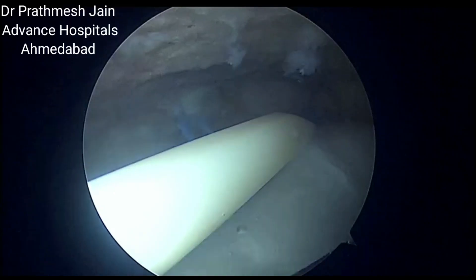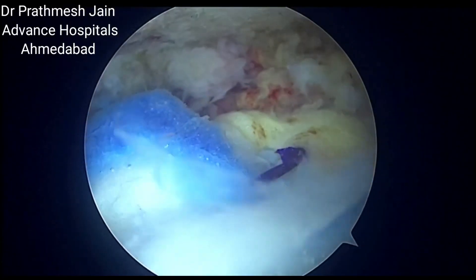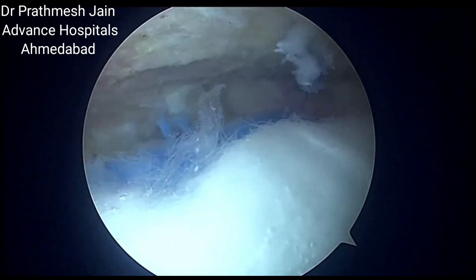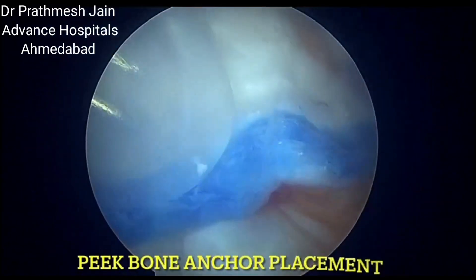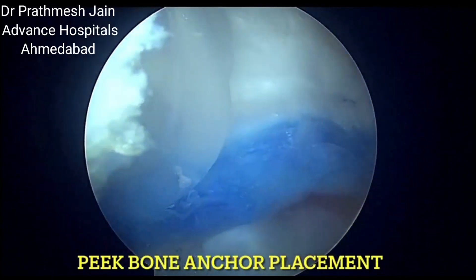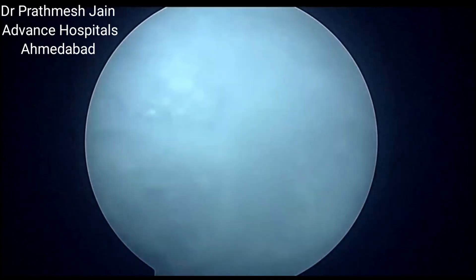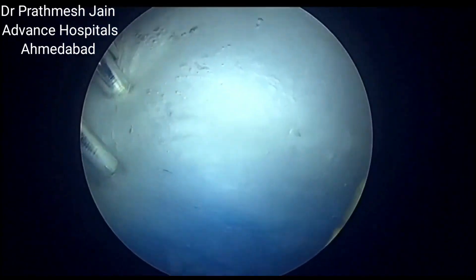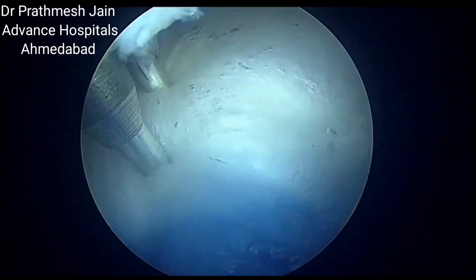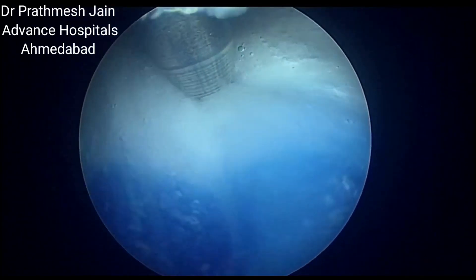Once the tendon anchor has been placed, we can remove the loader and then the next step is to place the peak bone anchor. The set comes with three peak bone anchors, but a minimum of two peak bone anchors are required to fix the graft.